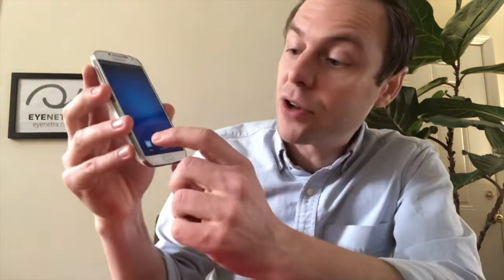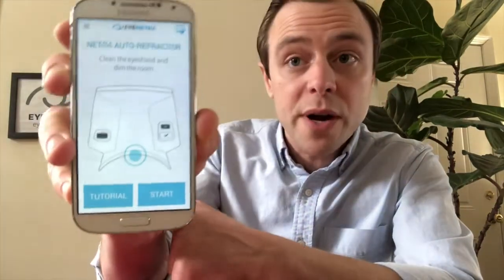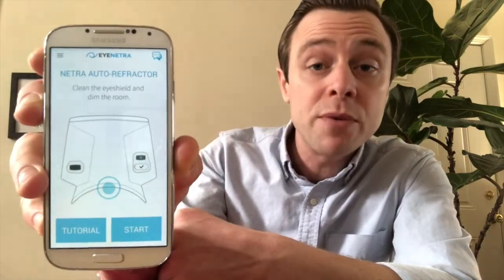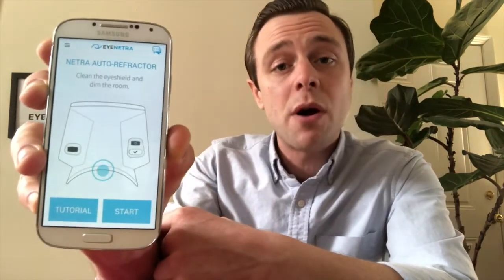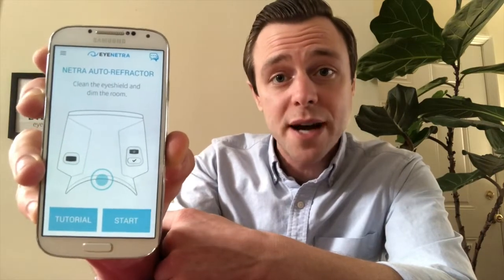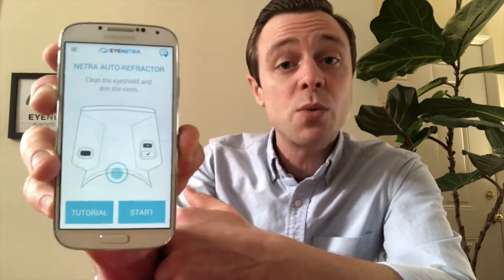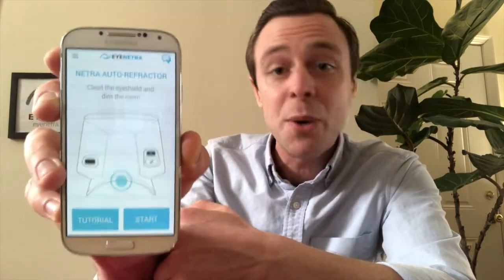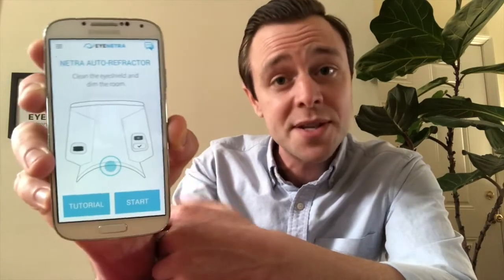When I remove the phone from the autorefractor and open up the Netra application, you'll notice right away we have two options: one for start, which will begin the test, and one for tutorial. Because the Netra autorefractor is a patient-driven device, it is very important that the patient has a working knowledge of the controls before going inside. We recommend using the tutorial as a training aid for your patients prior to each test.